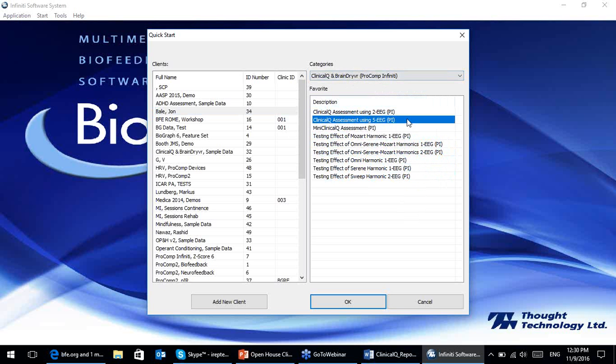assessment. The update, when you all get it, installs into your computer, and it will automatically have this quick start section linked to those new files. If you are one of those clever people who modified our software to better suit what you want, don't worry, I'm not deleting any of those files. I'm very careful in thinking about how we create software, and so we made sure that our new files are completely separate from the old files. Just within this quick start, it's going to link to the new files.